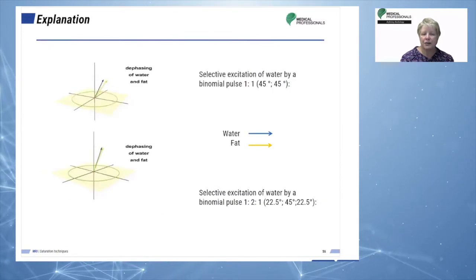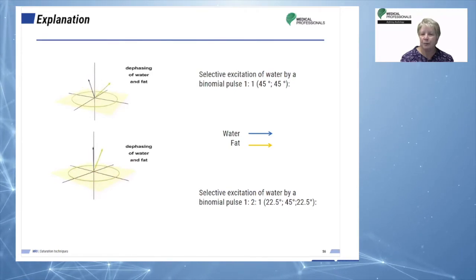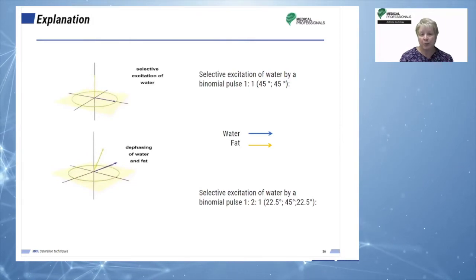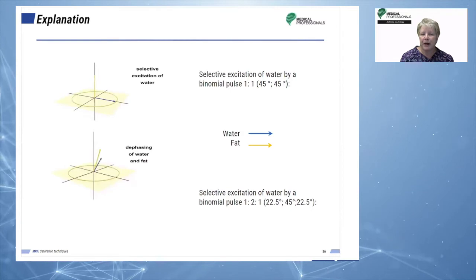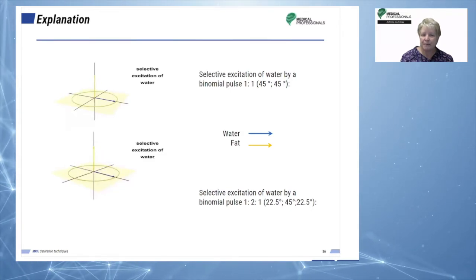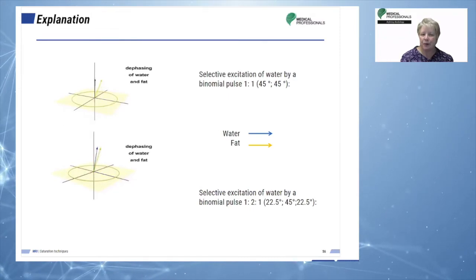This slide shows a minimum excitation of fat-bound protons and a maximum excitation of water-bound protons. Notice that when the order of the binomial pulse is higher, fat suppression is better. This is referred to as spectral excitation profile.